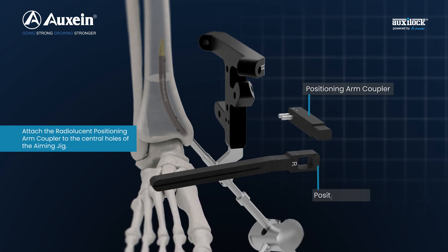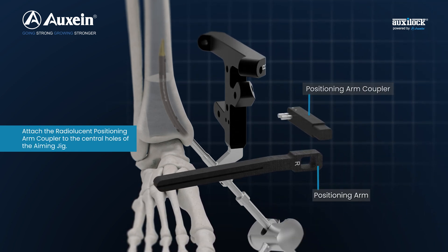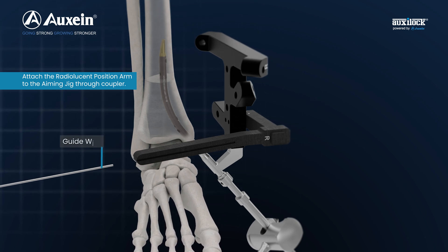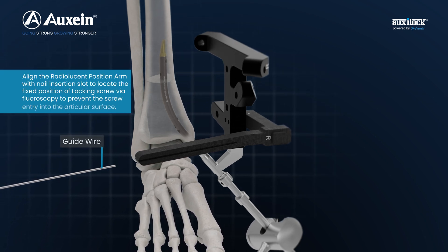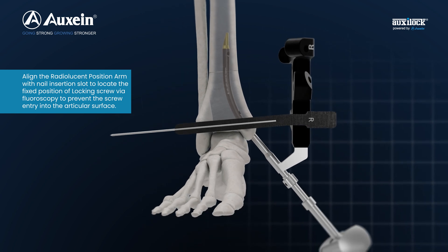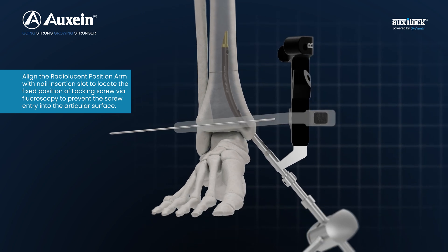Attach the radiolucent positioning arm coupler to the central holes of the aiming jig. Attach the radiolucent positioning arm to the aiming jig through the coupler. Align the radiolucent positioning arm with the nail insertion slot to locate the fixed position of the locking screw via fluoroscopy.